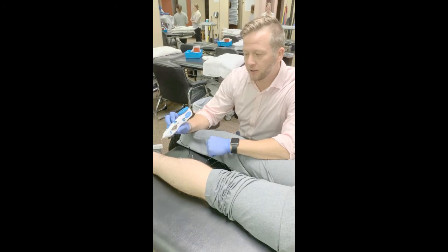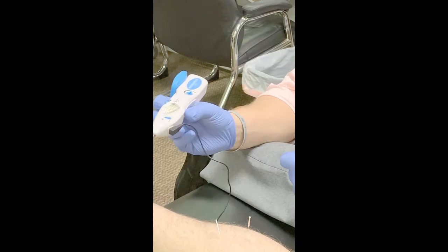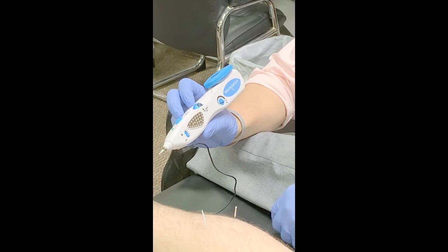Hey guys, Paul from iDry Needle, just going to run through a quick how to use the Pointer Excel LT. This is the only handheld unit, not everyone trained with it, so let's run through some of the basics.